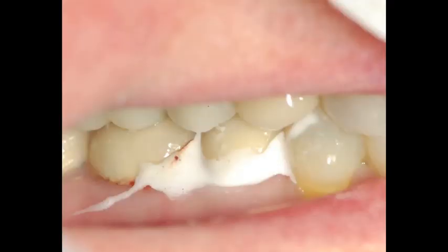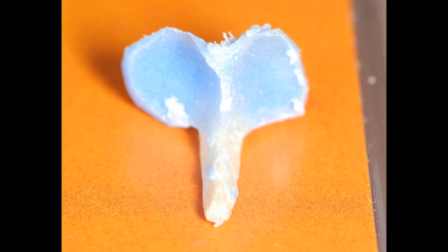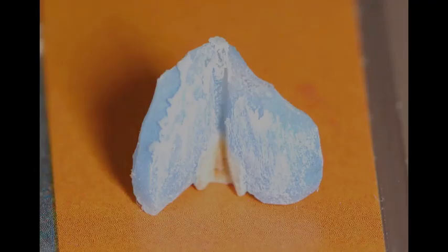Then one day I was cleaning up cement and it occurred to me that wedges no longer have to be triangular in shape, so I engineered the absolute best contact wedge — the ABC wedge. Not only is the wedge anatomically correct, but it has a groove down the back to line up the separating ring. This groove centers the ring and prevents it from slipping or popping off the tooth.